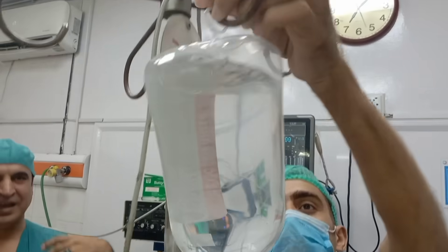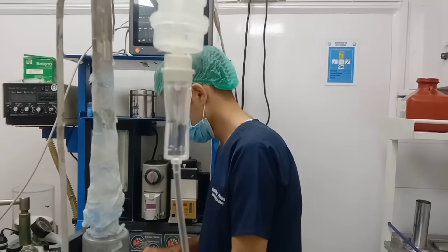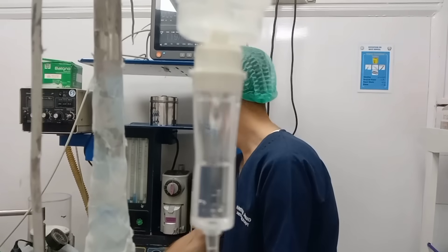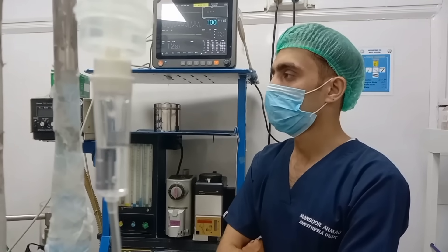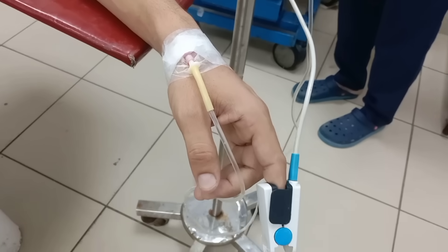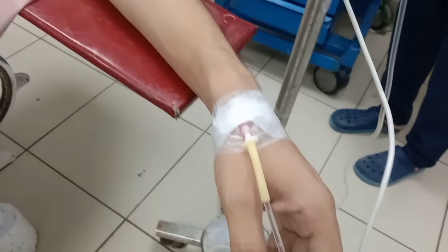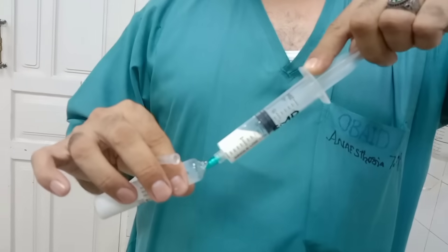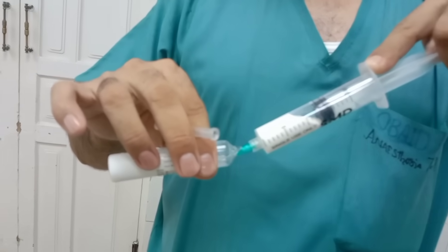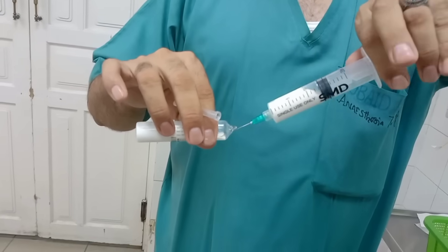Patient Preparation. First of all, I received the patient in the operation theater and positioned him comfortably on the operating table in the supine position. I attached the standard monitoring devices, including ECG electrodes to monitor the heart, a pulse oximeter on the finger to monitor oxygen saturation, and a blood pressure cuff to check blood pressure throughout the procedure.